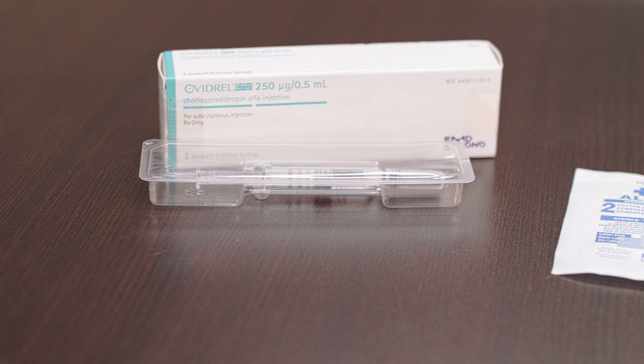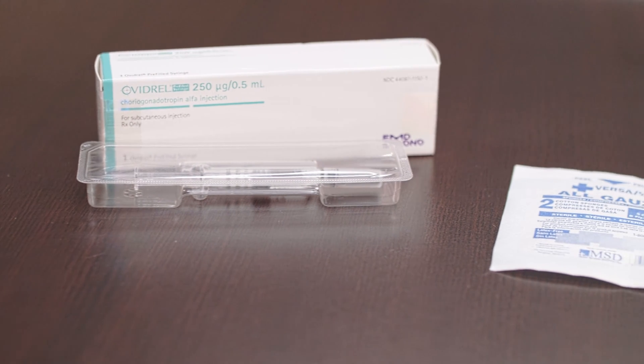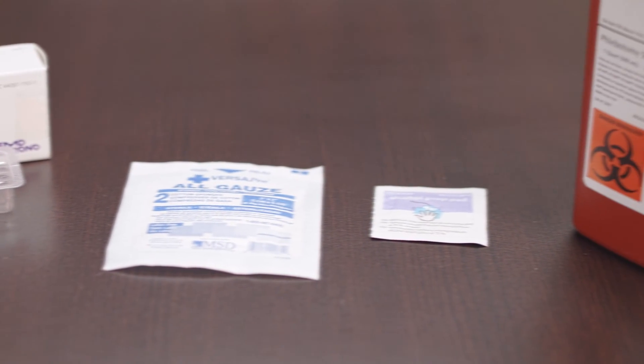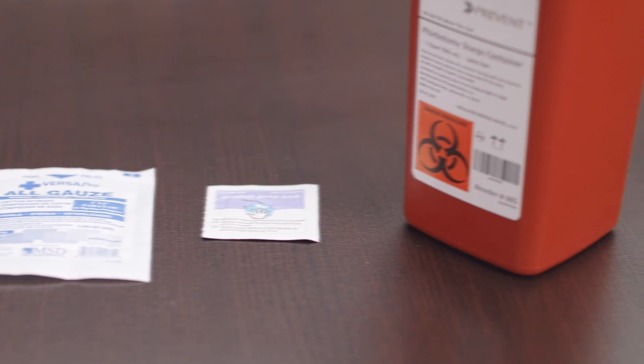First, you will need the following items: a sterile pre-filled Ovidril syringe, gauze, alcohol prep wipe, and a sharps container.